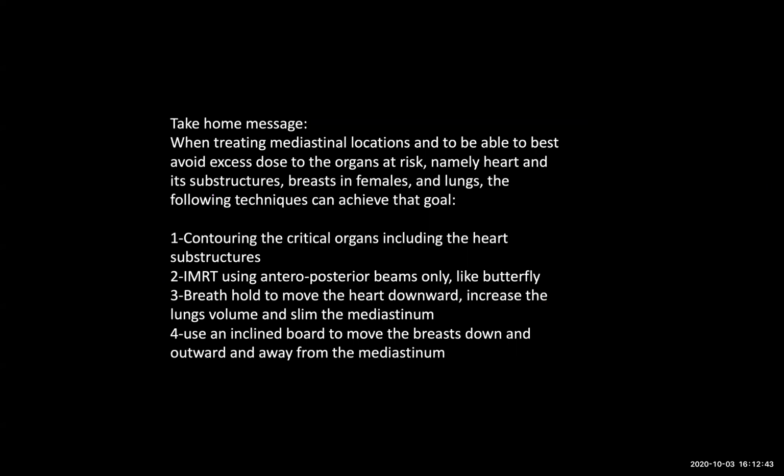So then the take-home message is that when treating mediastinal locations, to best avoid excess dose to the organs at risk, namely the heart and its substructures, breasts in females, and lungs, the following techniques can achieve that goal. 1, contouring the critical organs, including the heart substructures. 2, IMRT using anterior-posterior beams only, like the butterfly. 3, breath hold to move the heart downward, increase the lung volume and slim the mediastinum. 4, use an inclined board to move the breasts down and outward and away from the mediastinum.